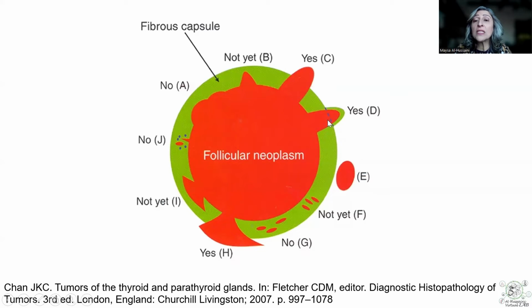And then if we see that whatever component we have, as well as part of the pseudo-fibrous capsule, extend beyond the true fibrous capsule, this also qualifies as capsular invasion. So besides the mushroom-shaped invasion, we can have this finger-like projection, sometimes accompanied by a fibrous pseudocapsule invasion. And in these three instances, these would qualify as capsular invasion.